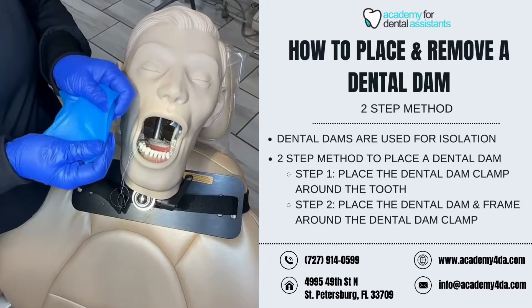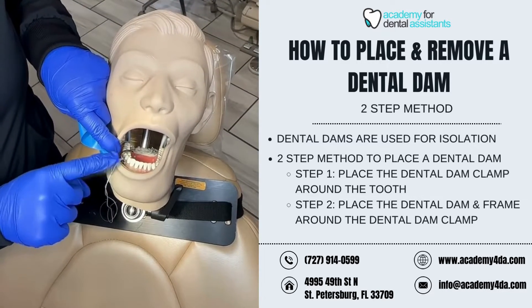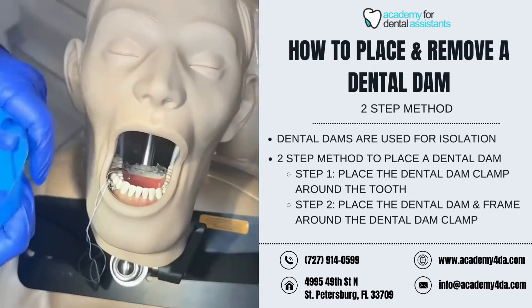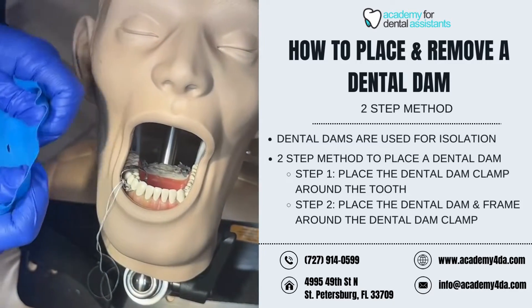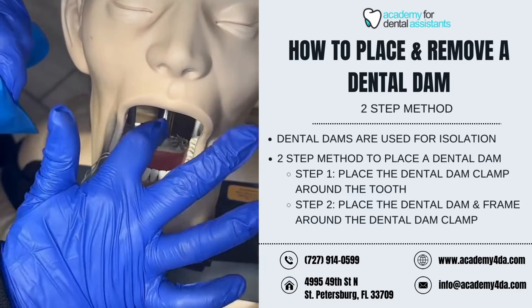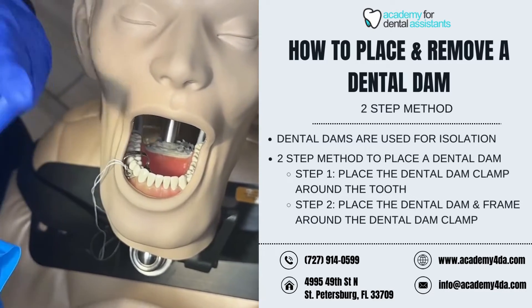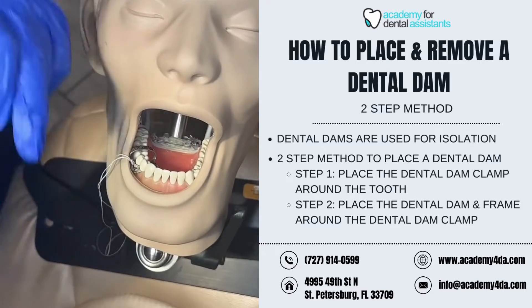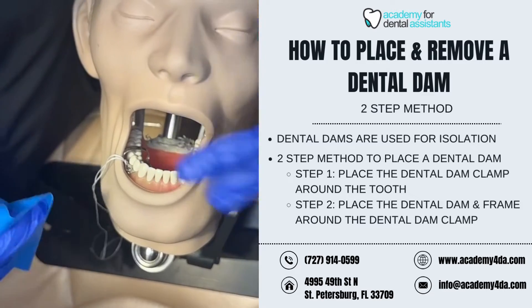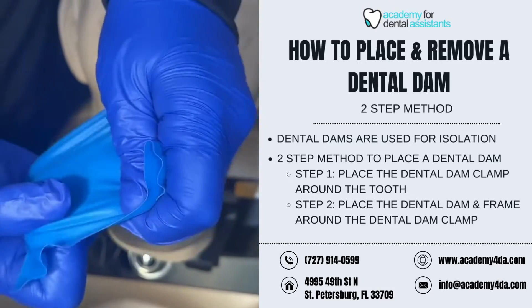With the hole punched in my dental dam, I'm going to start on more of the buccal facial side and stretch my hole, then fish it around all the way through the back of the dental dam. It's going to be a bit tricky — it might pop off — but I recommend using a finger as a fulcrum to help stabilize your dental dam clamp inside the patient's mouth.